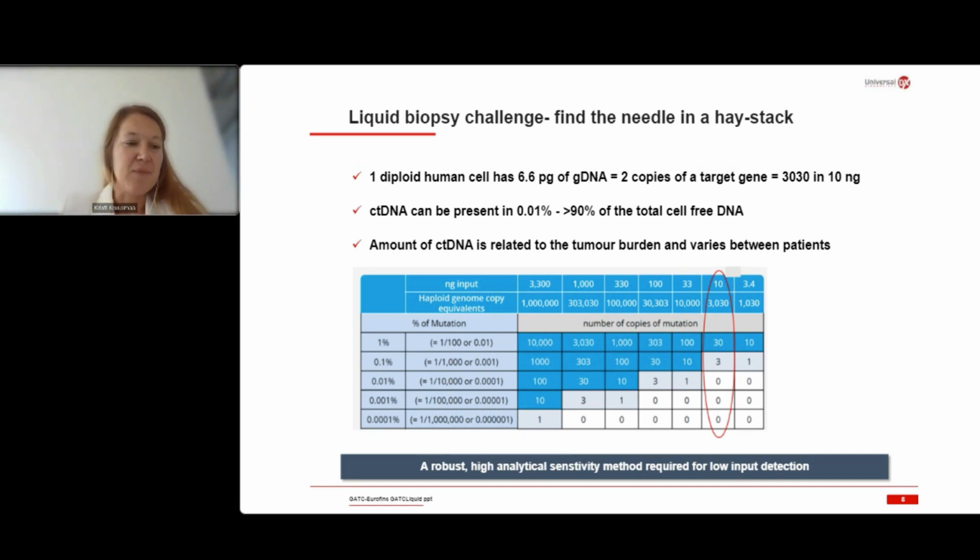There are other problems in terms of cancer and its heterogeneity itself, because especially in the early stages, cancer patients are presenting really different profiles. So it's not enough to detect one marker, to have a very accurate and analytically specific test only for one marker. Multiplexing really comes into play here. The more the better, because the disease itself is very complex. So it again poses certain limitations for qPCR and ddPCR usages.